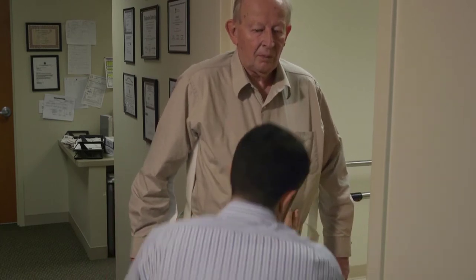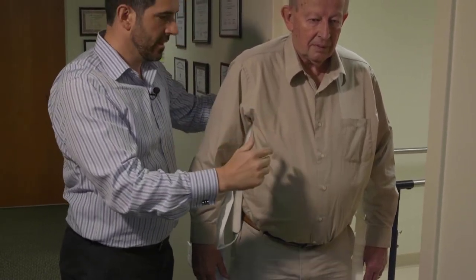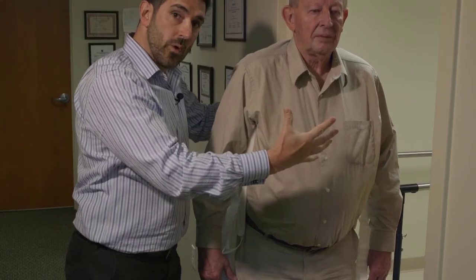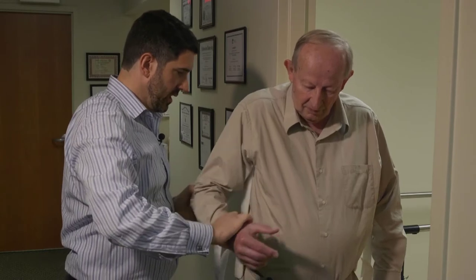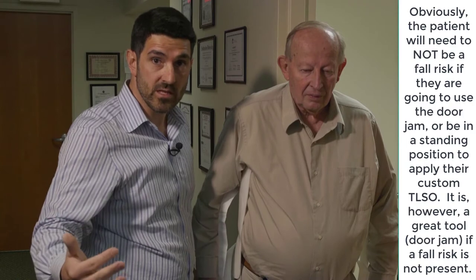The reason we do this in a door jamb is a couple of different reasons. When Bob takes one of these straps, he can pull back like this. If he's against a wall and pulling back, he's going to hit the wall. So that's one of the reasons why we promote the door jamb for patients. Some other places might tell their patients to do it differently, but this is the way we show people how to do it.